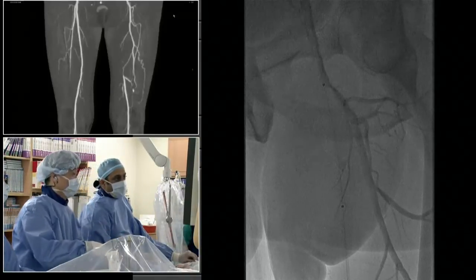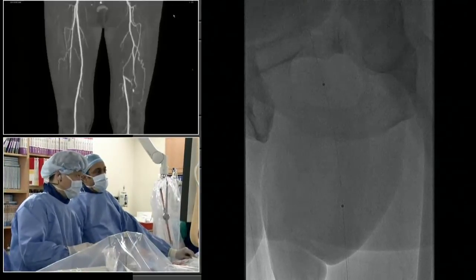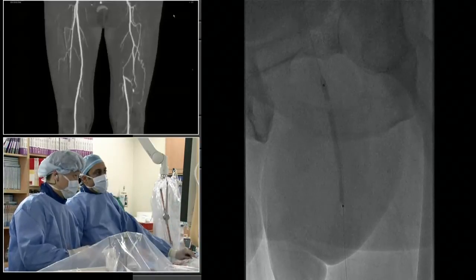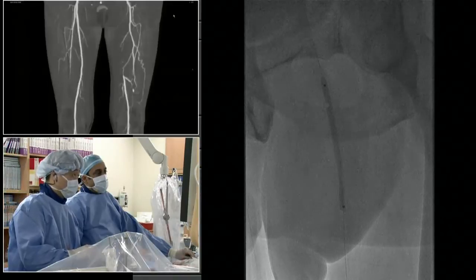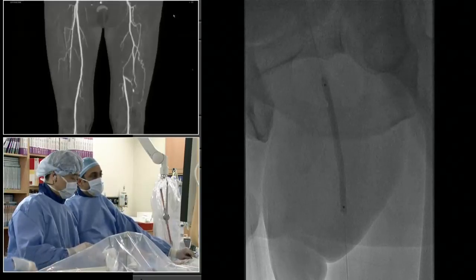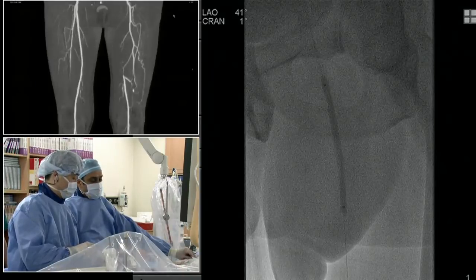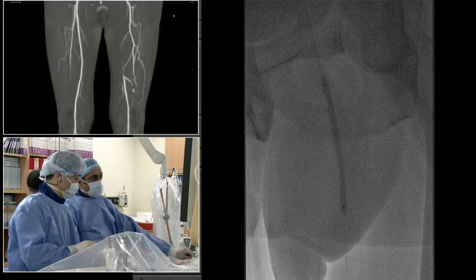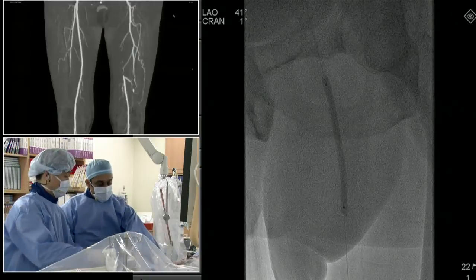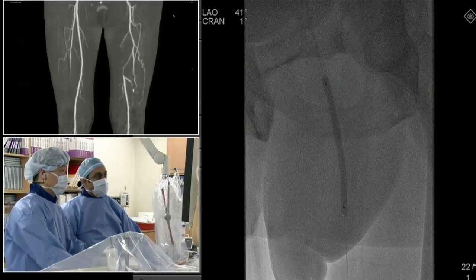I couldn't agree with you more. I think the one piece of this puzzle that we still have not heard is, if this is an approach that works, it has to work not only in the acute phase, but also in the longer-term phase. So if the failure mode on restenosis is, you know, laser or some other device, then the cost assessment later on may catch up with the upfront cost. But, again, I think we're speculating a lot about that. The point is exceedingly well taken that you take a very simple case and make it very expensive. But it's really looking at that next domino to fall, which is restenosis or the failure mode, which allows you to retreat.